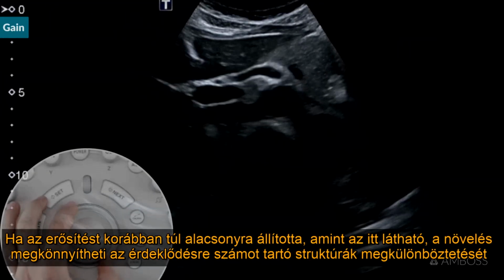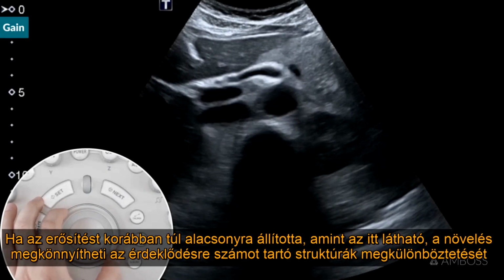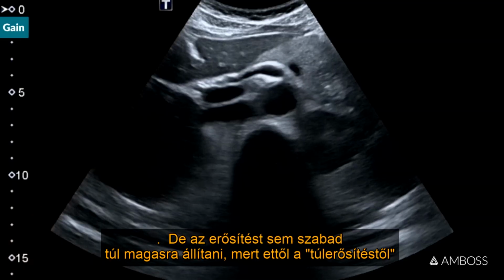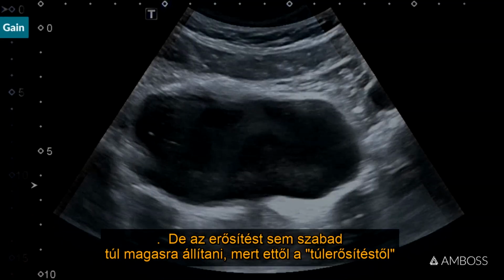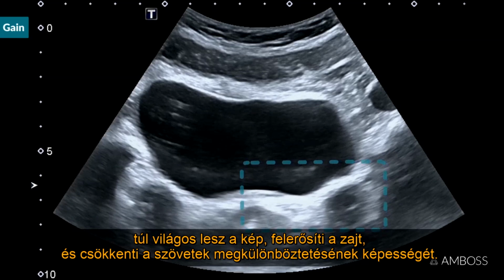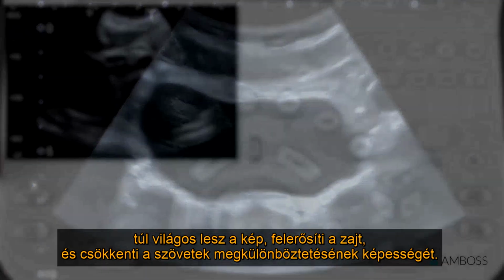If gain was previously set too low, as shown here, increasing it can make it easier to distinguish structures of interest. But the gain should not be set too high either, because this overgain will make the image too bright, amplify noise, and reduce your ability to differentiate tissues.